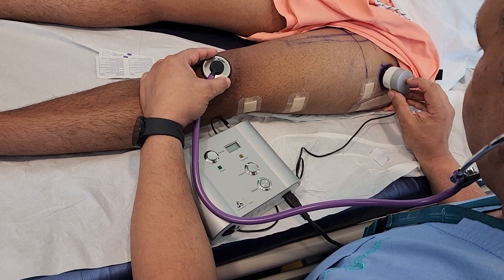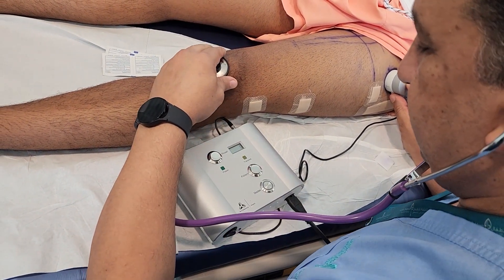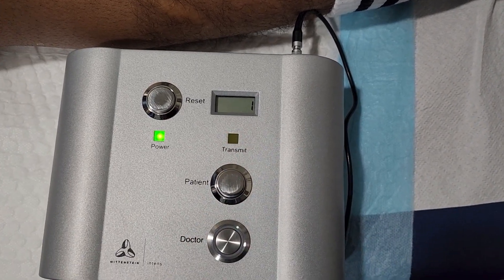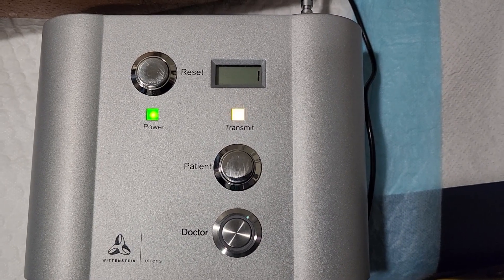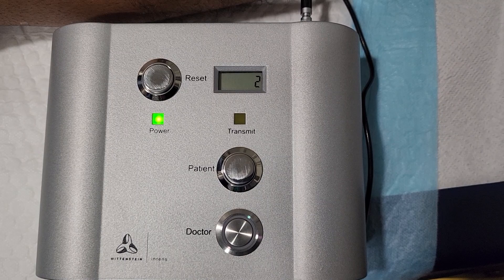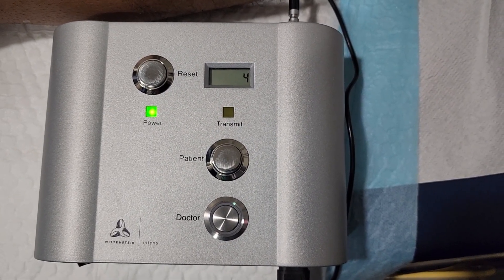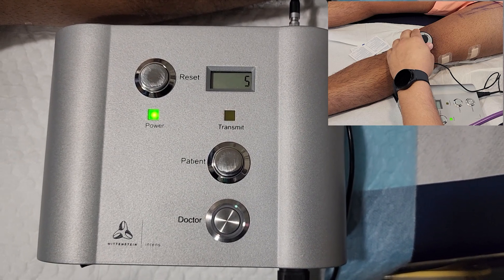We place the transmitter over the receiver and then start lengthening by pressing the Patient button. Make sure the machine is switched on — the green light should be lit. After pressing the Patient button, you can see the orange light flashing every few seconds, and with each flash the number increases. You can watch it go from three to four to five, all the way up to nine. Once you reach nine, you have completed one cycle of lengthening. The rising number, the flashing orange light, and hearing the engine through the stethoscope — these three things together ensure the lengthening process is going correctly.